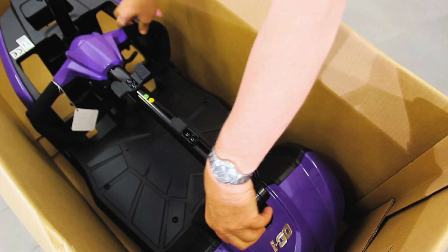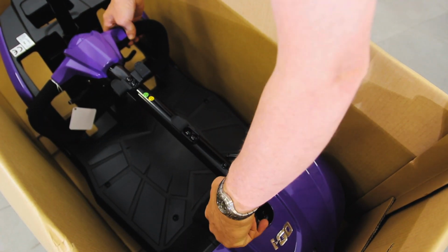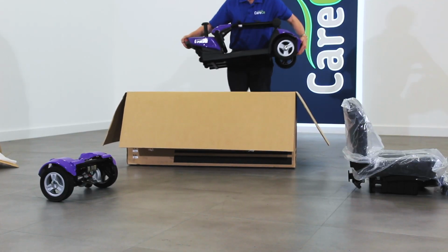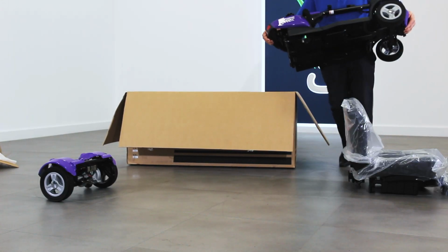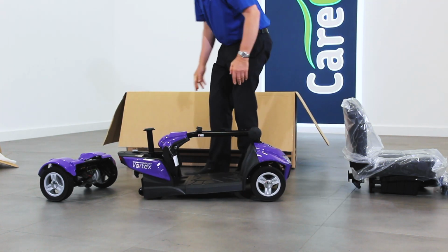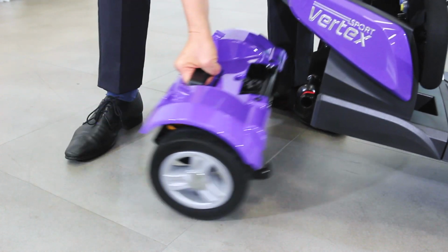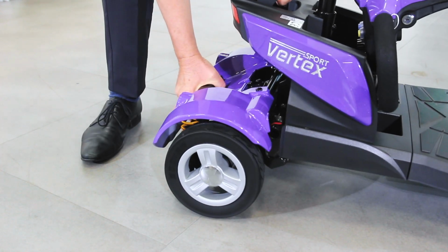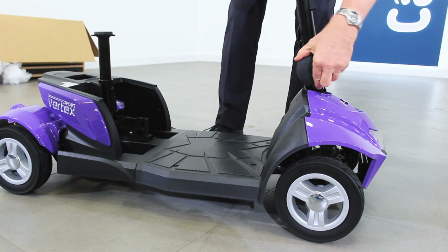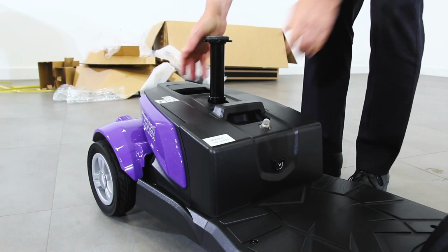Lower the tiller bar on the front section, then lock it again before lifting. The front section is the heaviest part of the scooter, weighing just over 20 kilos, so please take care to adopt a comfortable posture and lift with both hands. Line up the red markers on the underside of the front and rear sections to reconnect both halves. Lift and lock the tiller bar, then drop the battery back into place.